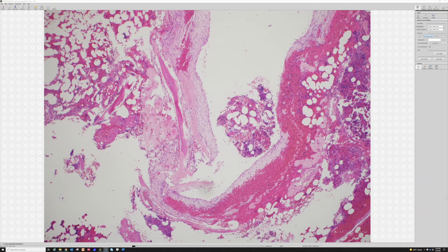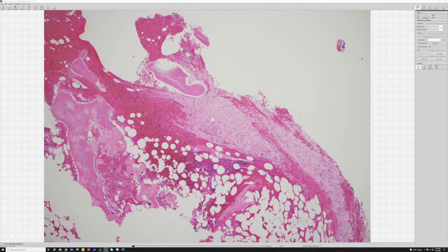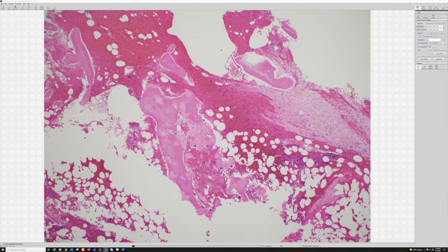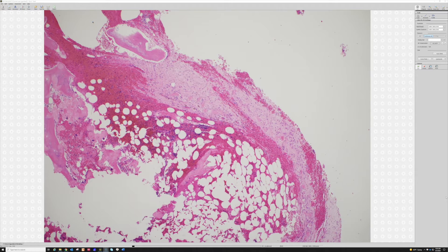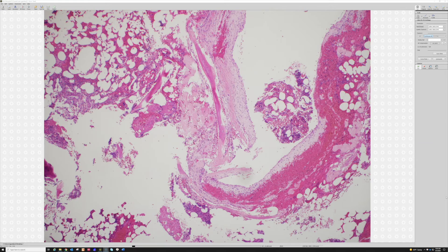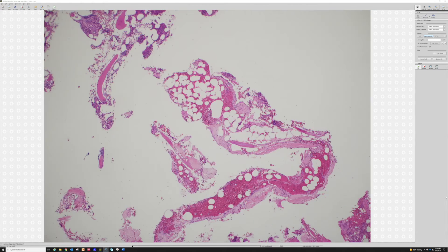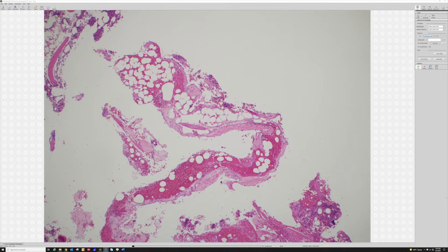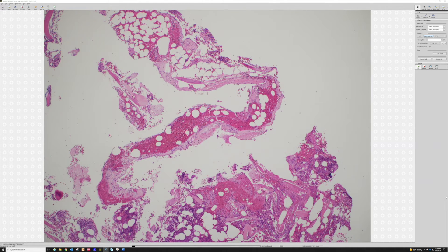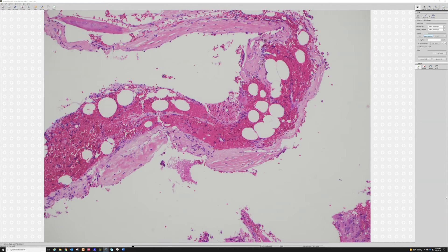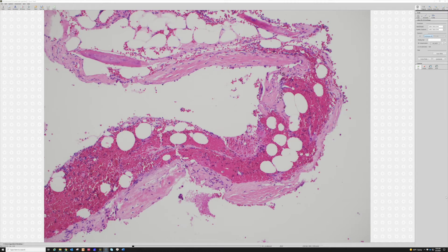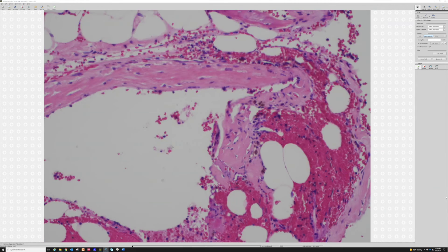It's also known as a simple bone cyst or a unicameral bone cyst, although those latter two names are a bit of a misnomer because these are sometimes multi-loculated rather than a single simple cystic space. They're not super exciting to look at because they just have this thin wall. I find the homogenized pink material to be one of the most helpful microscopic findings. Here's another thin fibrous membrane making the wall of the cyst, and there can be some blood — even though these are fluid-filled, there may be bleeding into them, resulting in hemosiderin deposits.